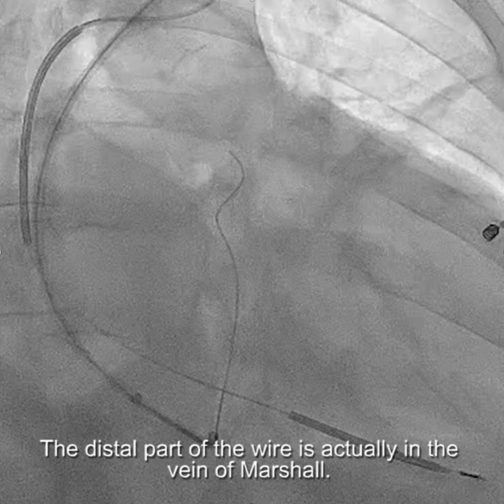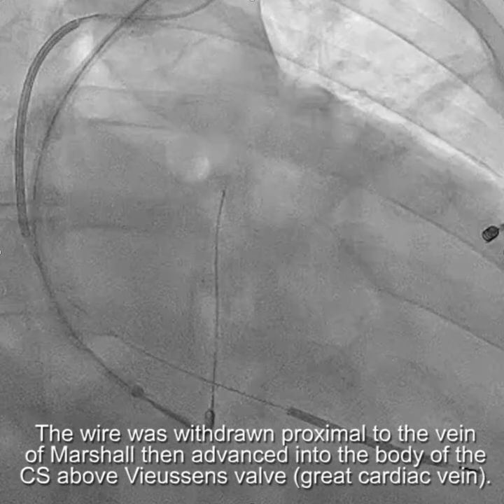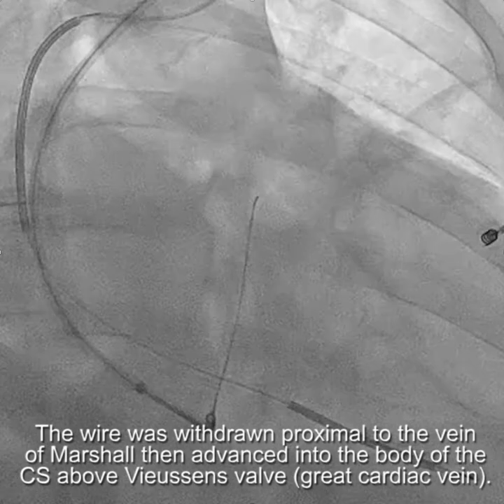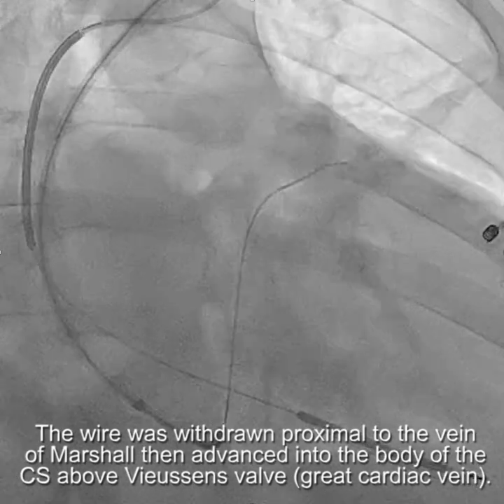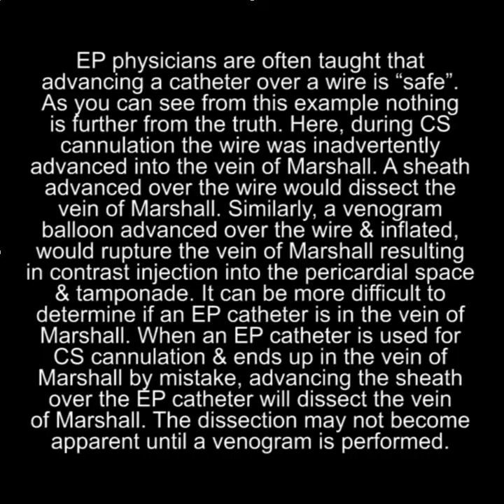When the wire is withdrawn below Vusensian's valve and then re-advanced, you can see that it has gone into the great cardiac vein above Vusensian's valve.